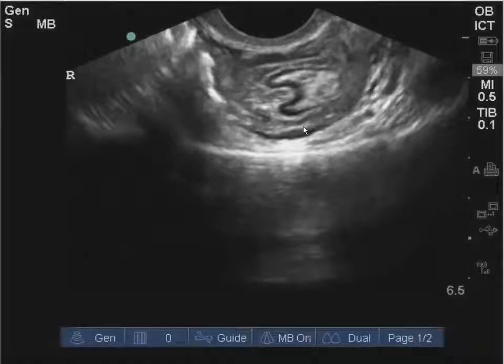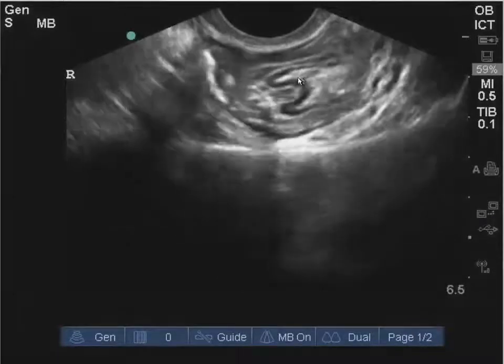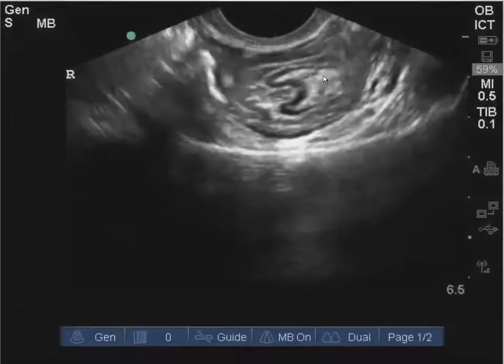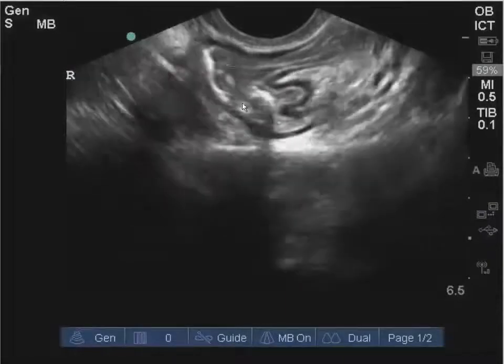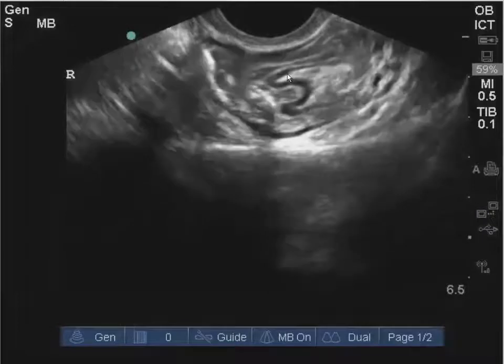So what I'm hinting at here is this patient's got intussusception, which is not very common in adults. But what you'll see is you pretty clearly see these multiple layers of bowel, and as you fan through, you can actually see the intussusceptum telescoped inside of the intussuscipiens. Intussuscipiens is the outer part, intussusceptum is the inner part of the intestine.